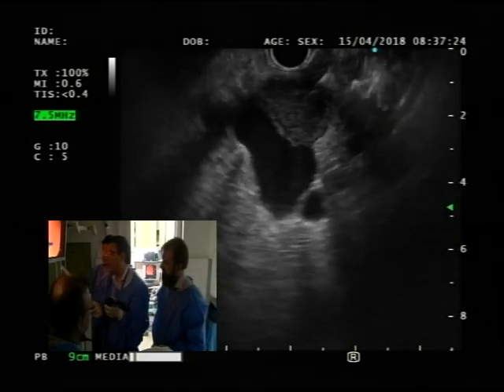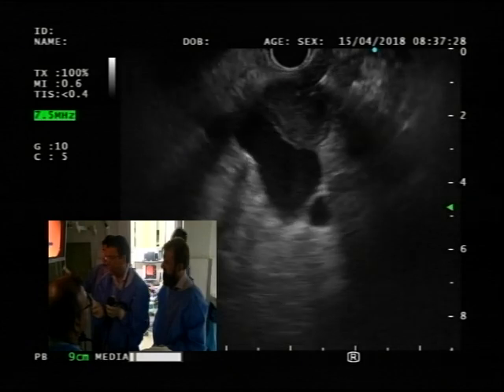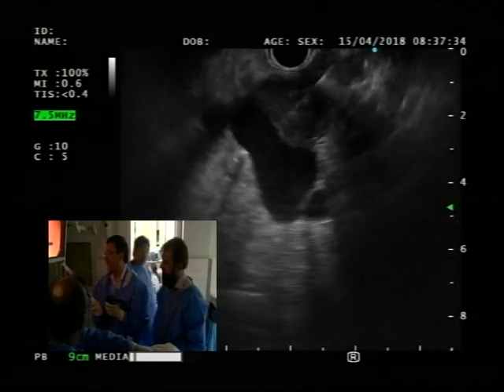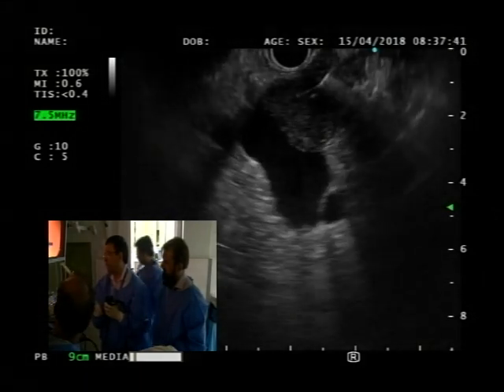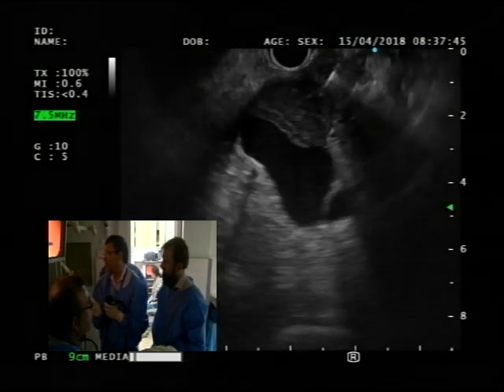So what we're going to do is we'll get some tissue, we should get some clot from here, and then we'll make some slides. I don't want to do a second pass unless it's sensible. If we only see blood then we're done. I'll come and have a look along with you, okay? Otherwise, we have served lunch here, okay? We're done with endoscopy.